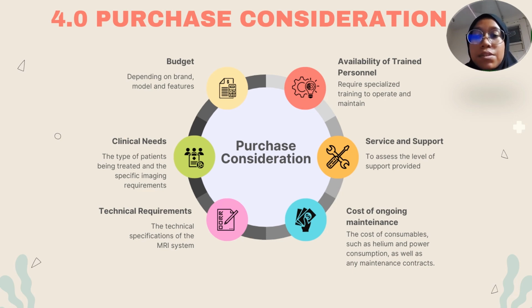Fifth, service and support. The level of service and support provided by the manufacturer can impact the overall performance of MRI systems. It's important to assess the level of support provided, including any ongoing technical assistance and maintenance.